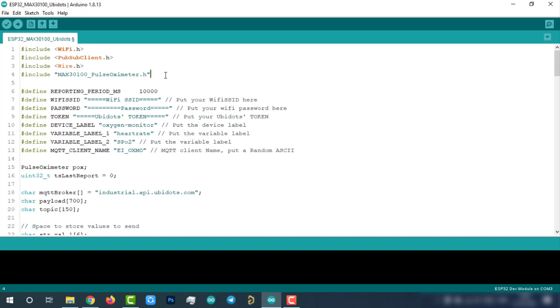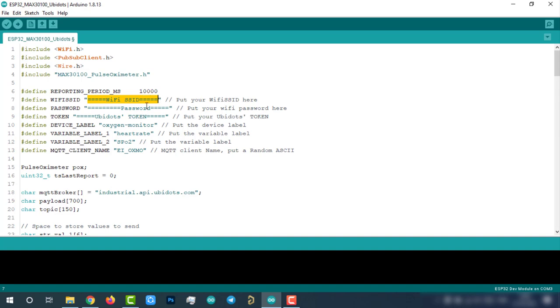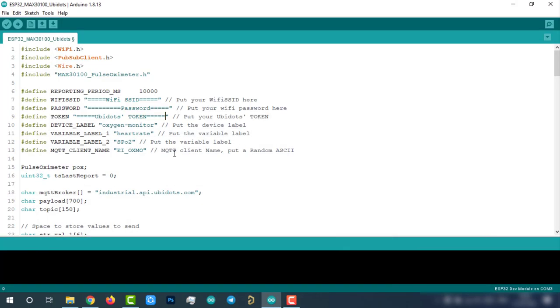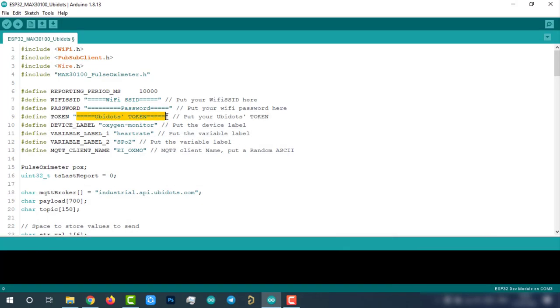To make this code work with your ESP32, you have to enter these three parameters. Enter SSID and password to give access to the internet. Then enter your Ubidots token. This can be found on the Ubidots account API credentials. Now this code is ready to upload to the ESP32.